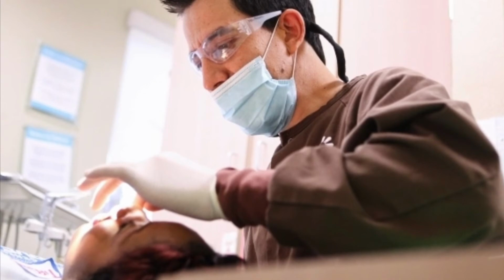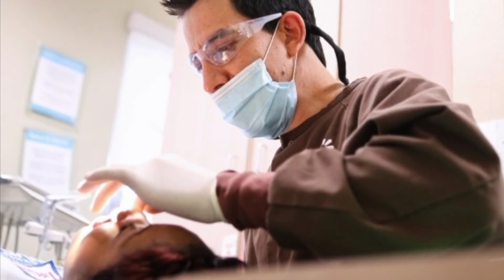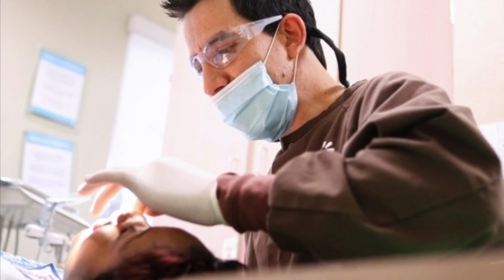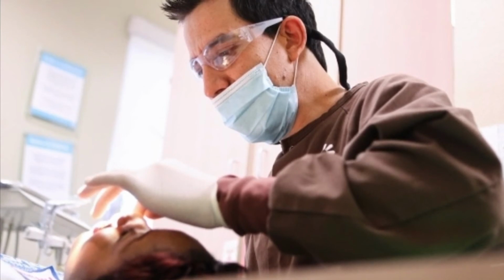When the exposure is done to a multi-canaled tooth, the canals may be superimposed and difficult to differentiate. If the X-ray cone is deviated mesially or distally with a given angle, the roots will separate in the film.